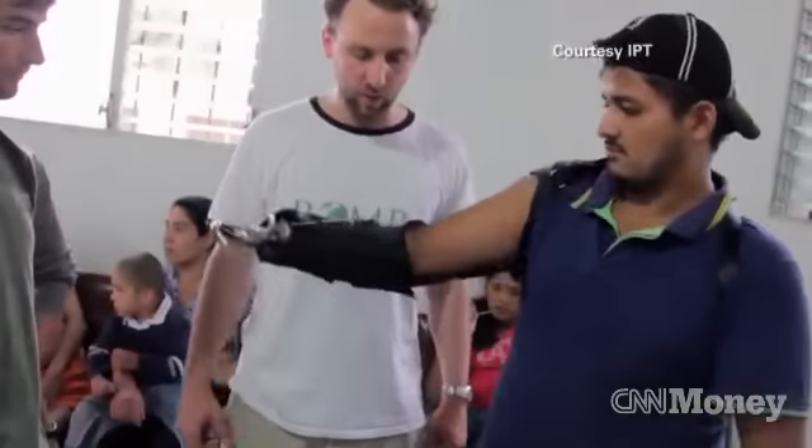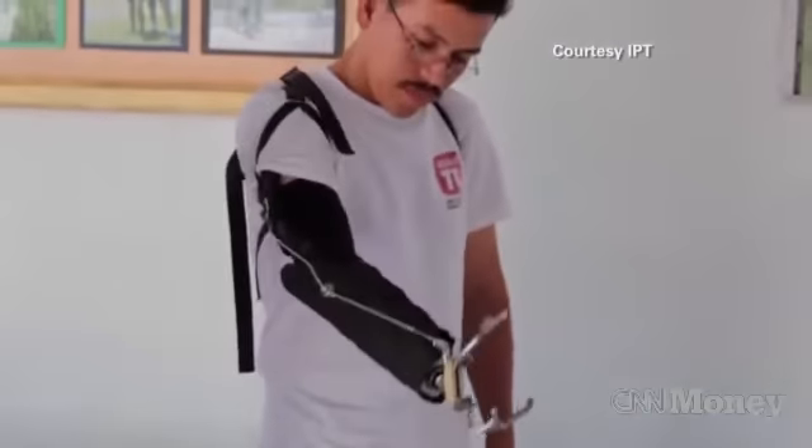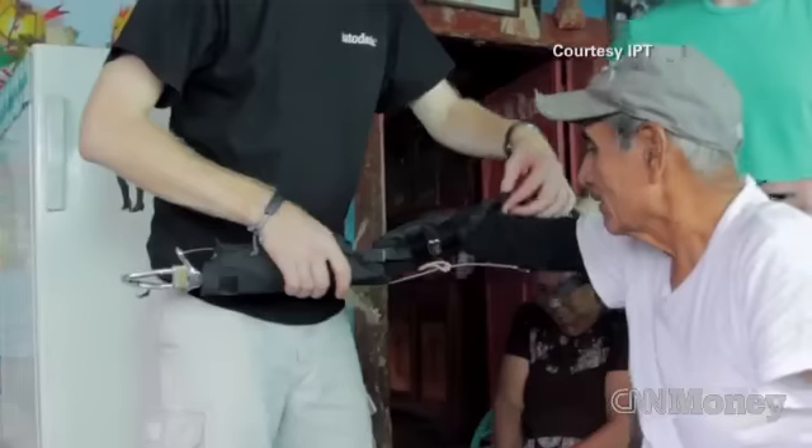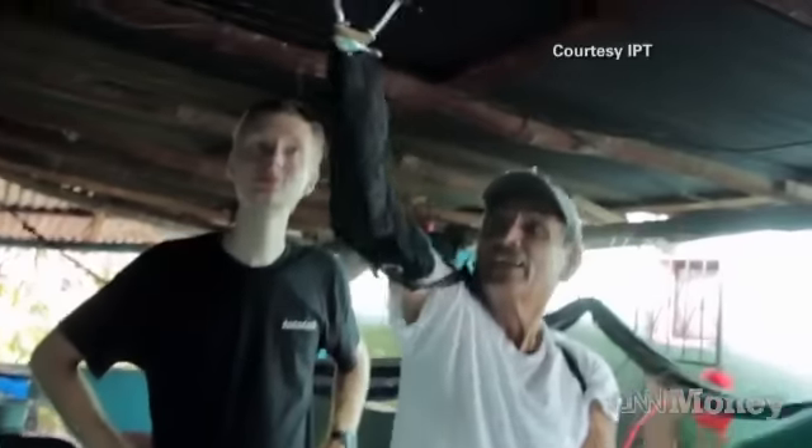The group is now working with amputees in Guatemala to test the device. Everyone has the right to have access to prosthetic care. By creating this technology, we can allow people to regain independence that they may have lost by losing their limb.